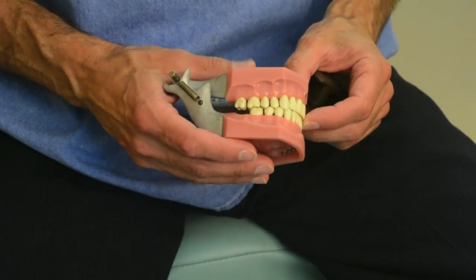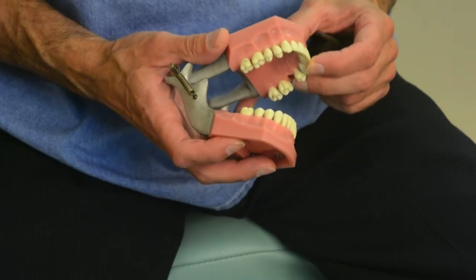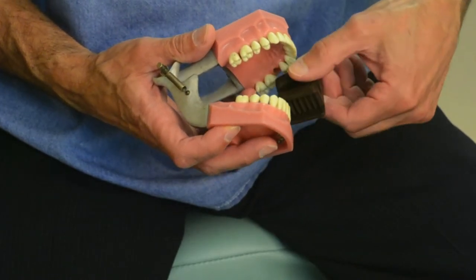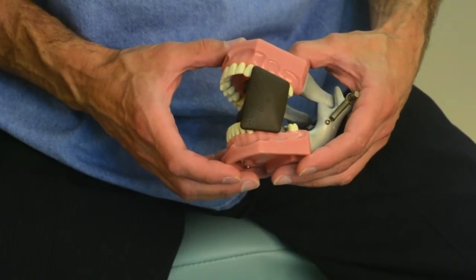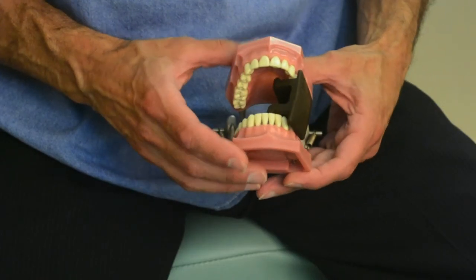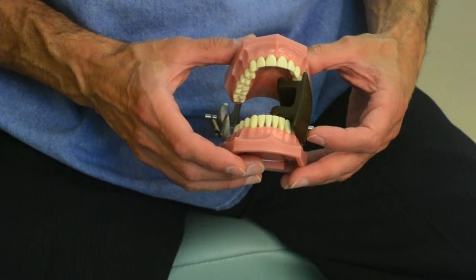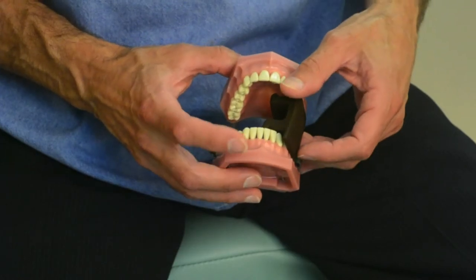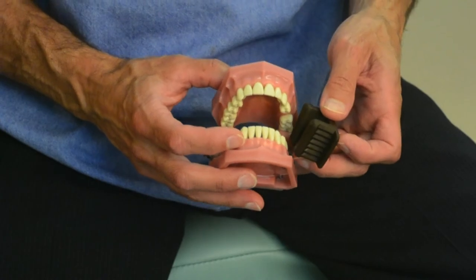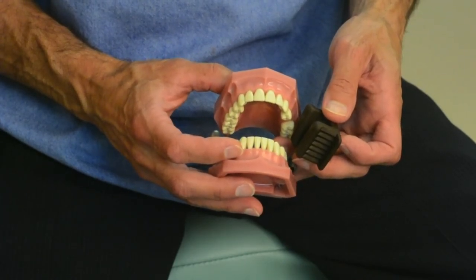Once the patient is adequately anesthetized, they can oftentimes open their mouth sufficiently to allow for the insertion of a bite block. I've inserted an adult bite block here for demonstration purposes, but usually this causes too wide an opening, so in most instances a child or pediatric bite block is indicated for performing closed reductions.